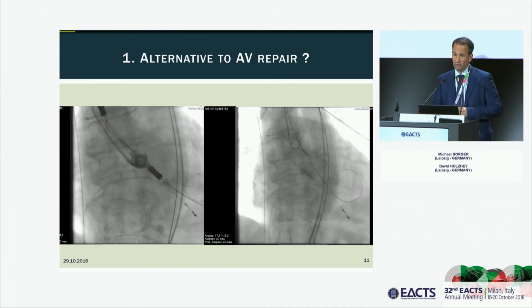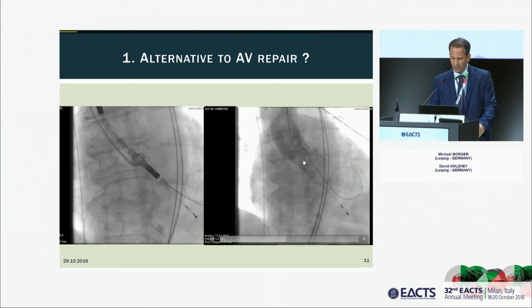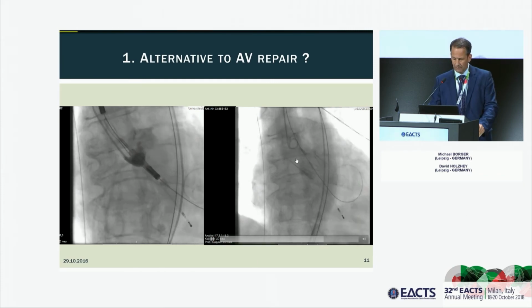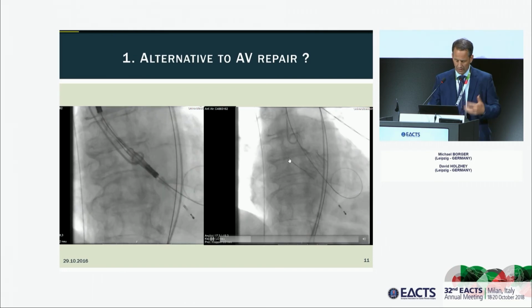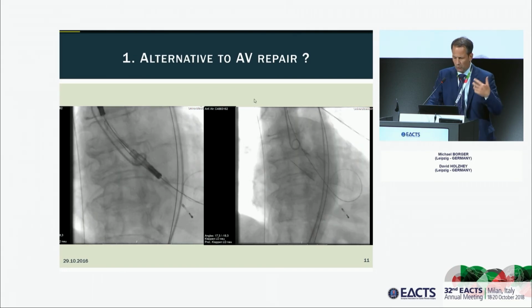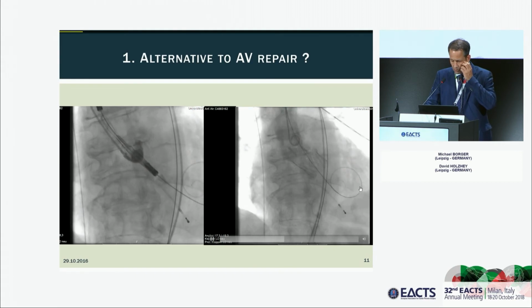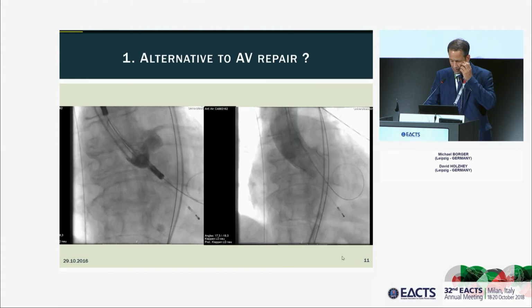And of course, we are always concerned about potential embolization. We think maybe with the Boston Accurate device that these stabilization wings in the ascending aorta will prevent against subsequent embolization, and therefore it was chosen in this case, and we got a good result.